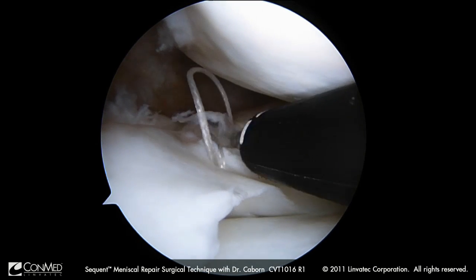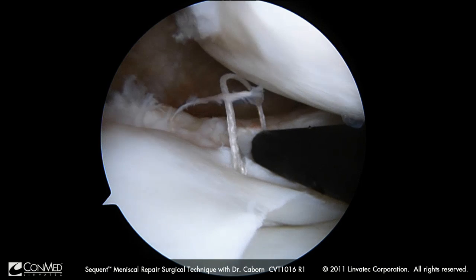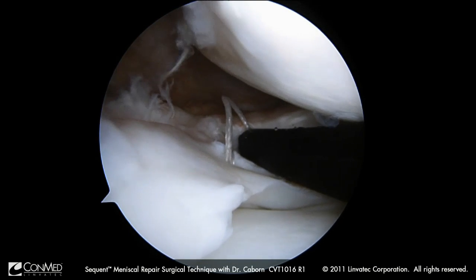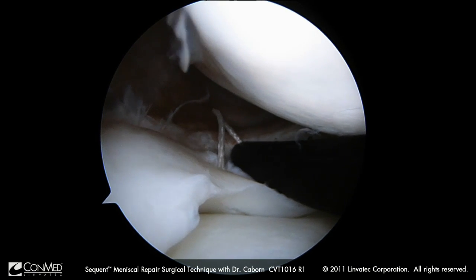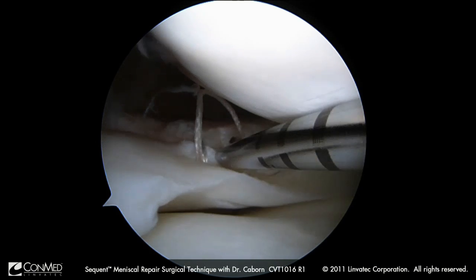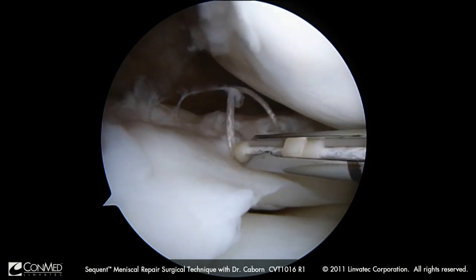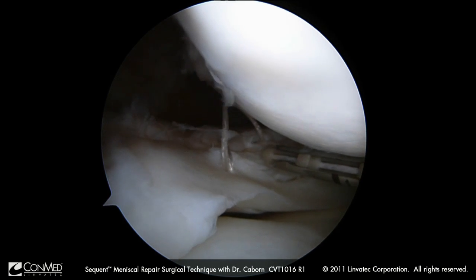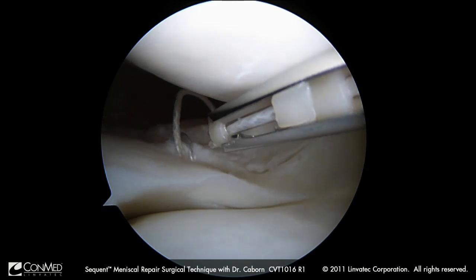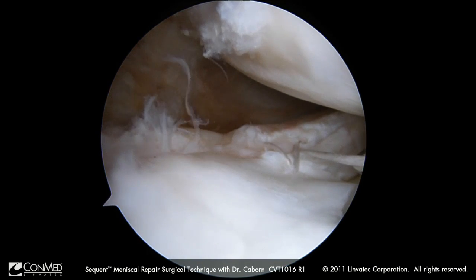We are going to go through the top cusp there. As I go through, I am going to drop my hand, then pierce the meniscus, do my two rotations — and you see how that is starting to take the slack out of the system. I activate my triggering mechanism, then deploy my implant, coming back slowly with my hand staying down. We then go to ratchet mode — red on — to retake the tension out of our system. You can see here nicely ratcheting back, and look at how we have got this apposition — a V configuration now, bringing that meniscus nicely together.